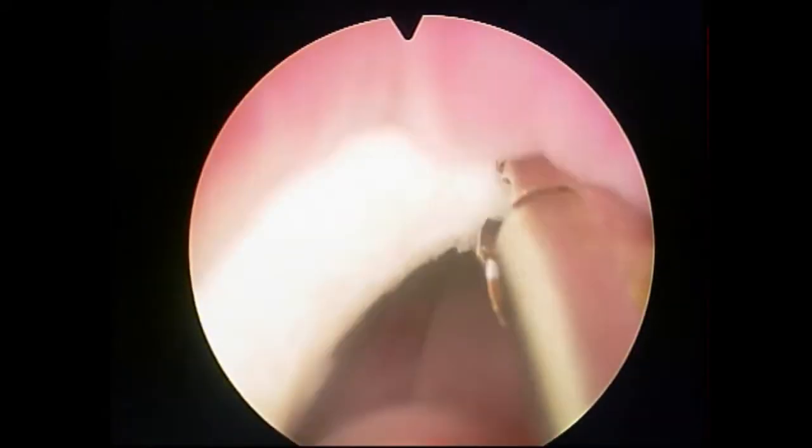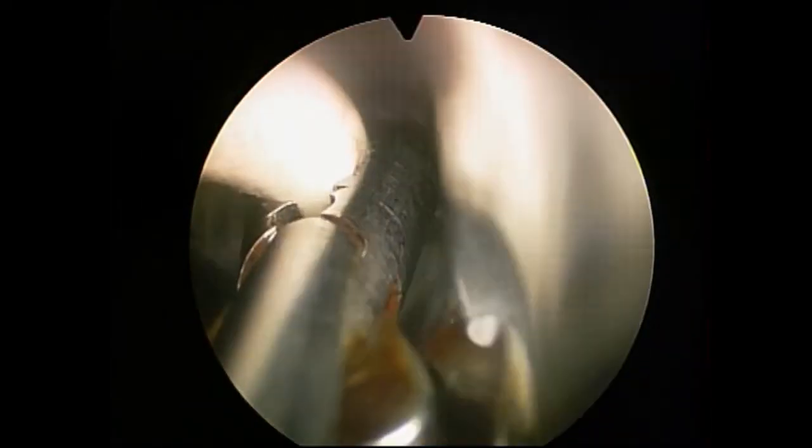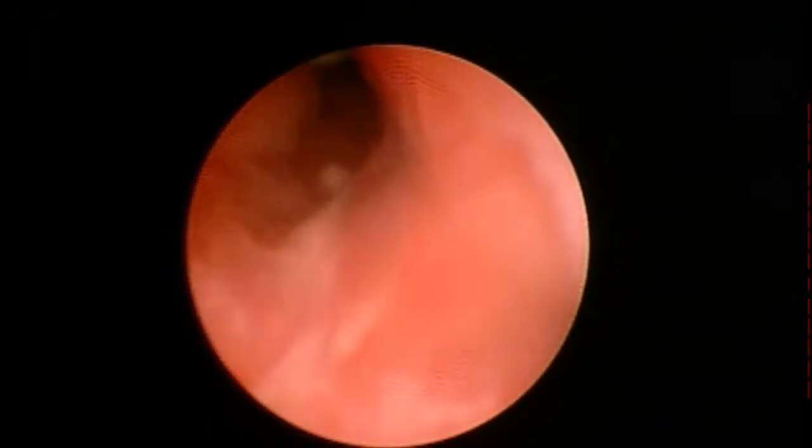The stent is removed and the guide wire is inserted. The ureteroscope is introduced and the ureter is found to be wide. There is no longer any stenosis.